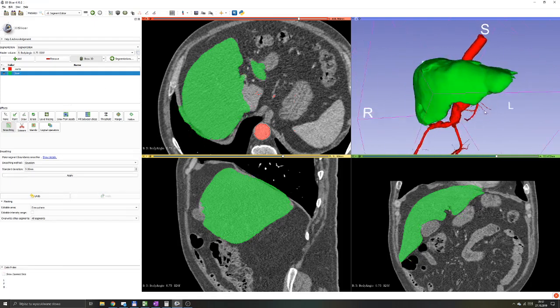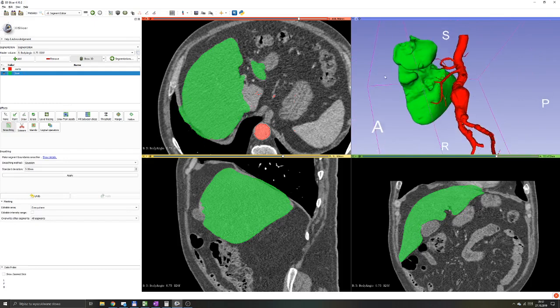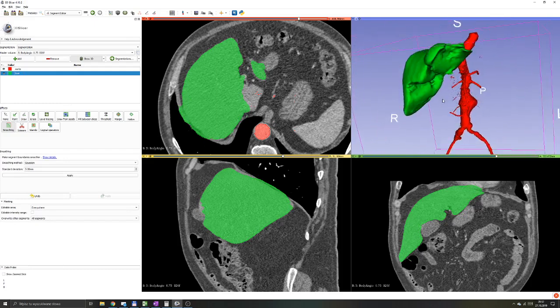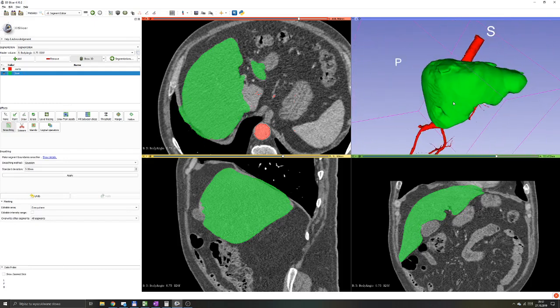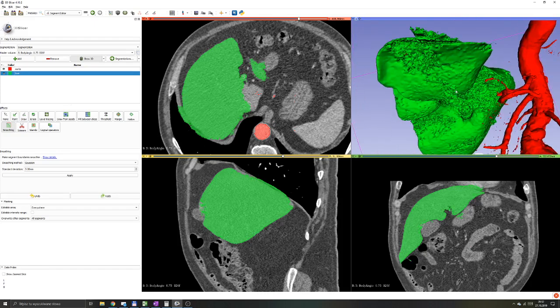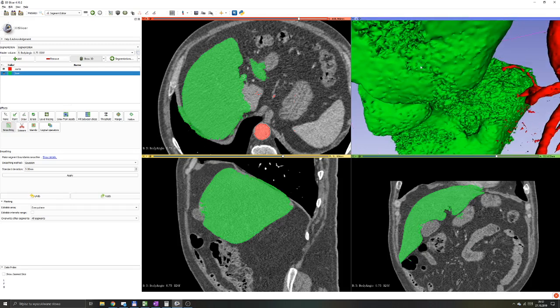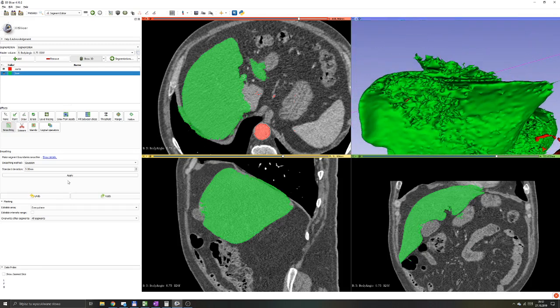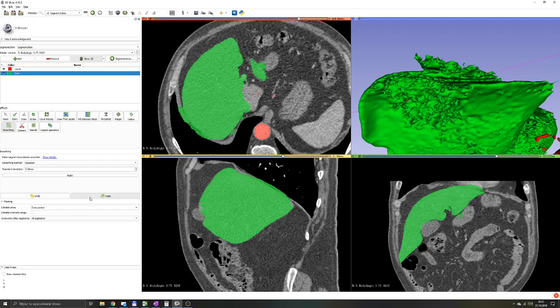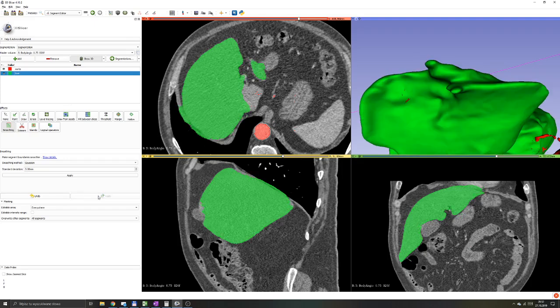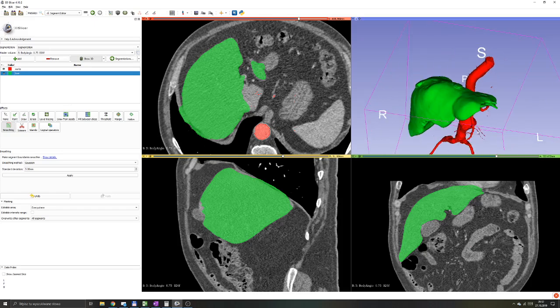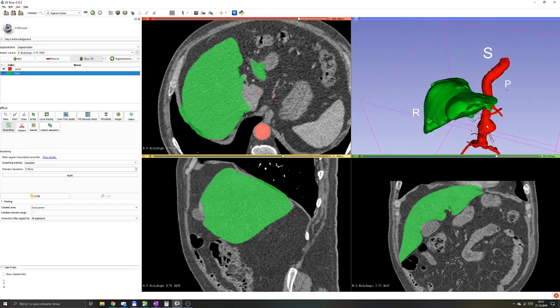As you can see, it smoothed the liver pretty nicely. It's still not perfect, but for me it's already way better. We don't have all that noise and stuff that we wanted to smooth out. Now it's relatively ready to export and to show it to a doctor, or even to 3D print it.